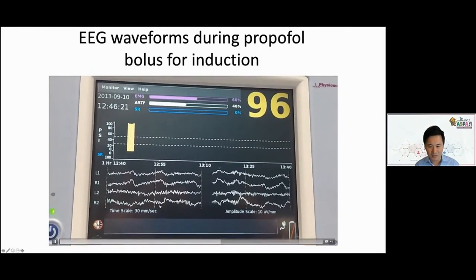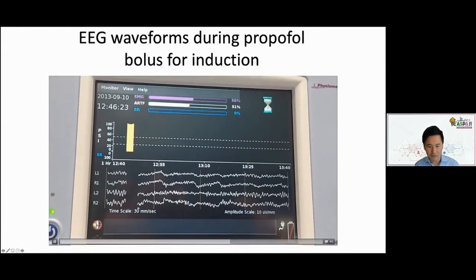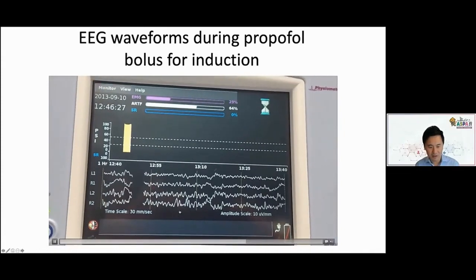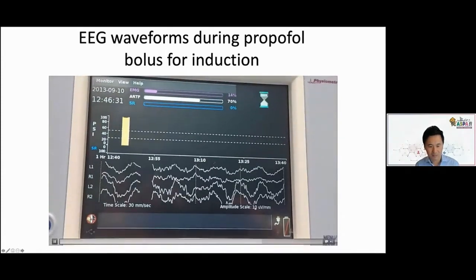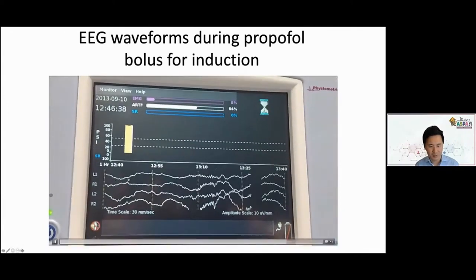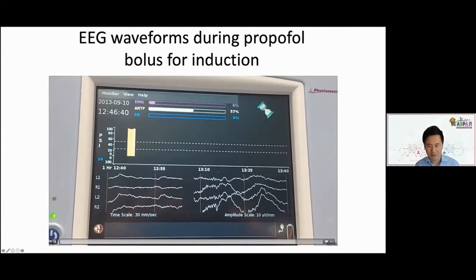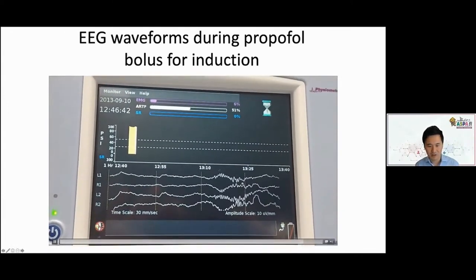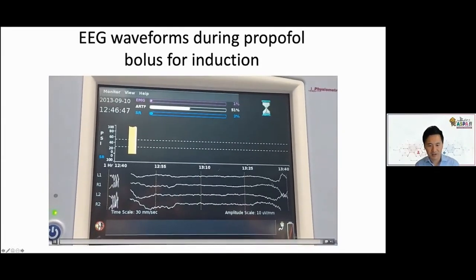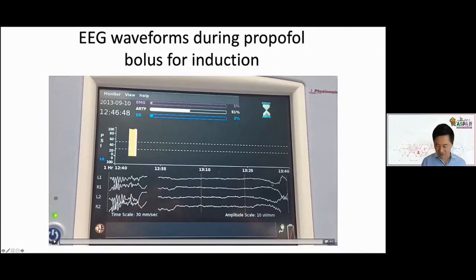Now some oscillations, beta, slowing to alpha, alpha. Slow oscillation. And now we're into some suppression, burst, suppression, burst. All right, so we saw that earlier, but I think it's worth another review.